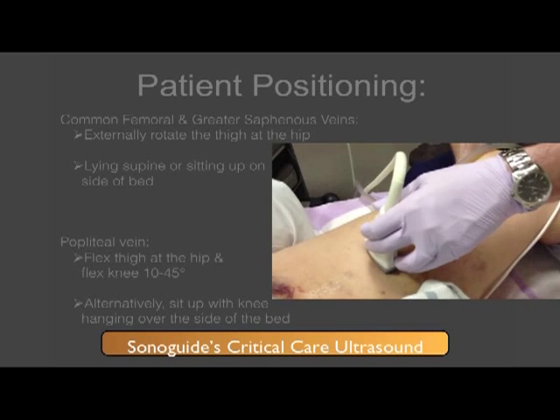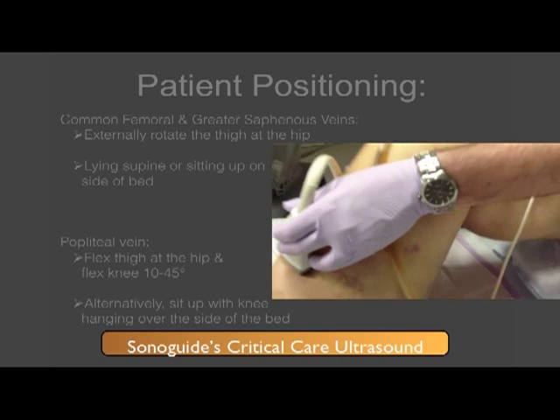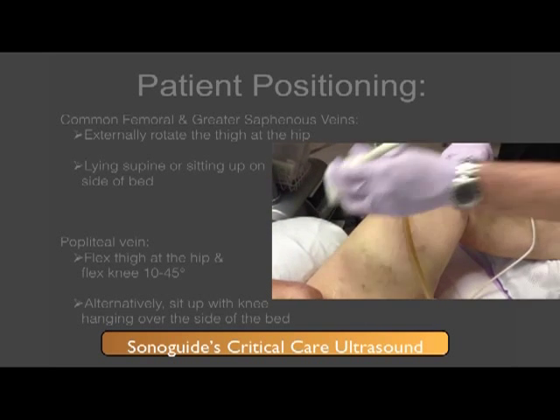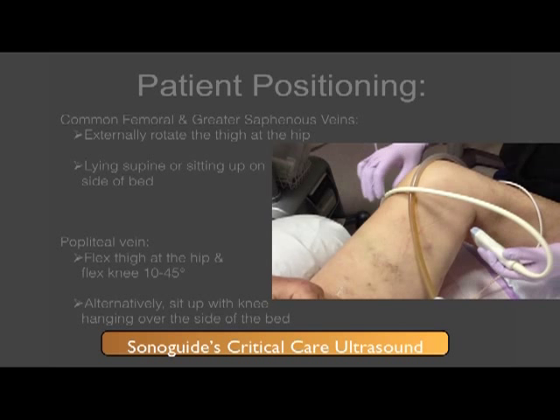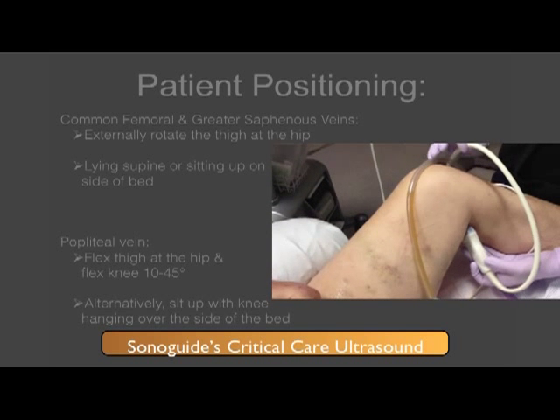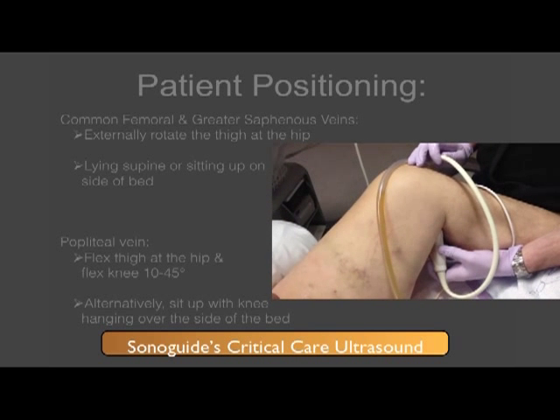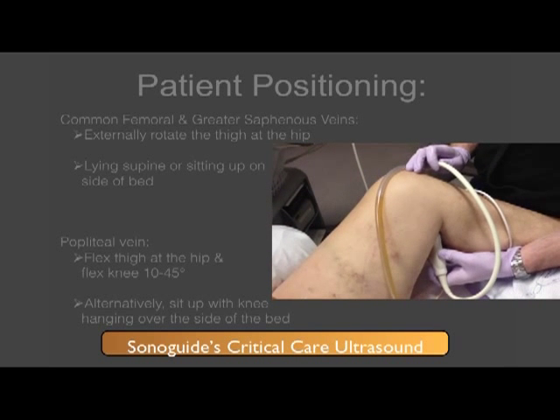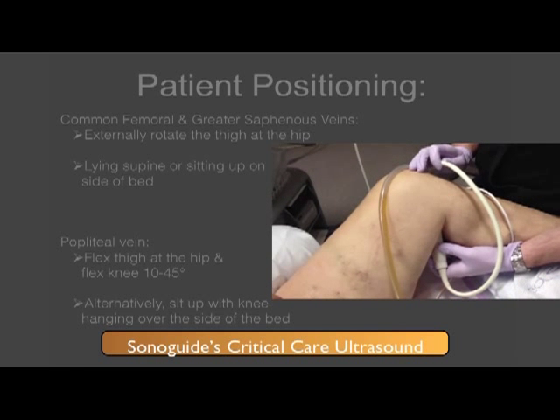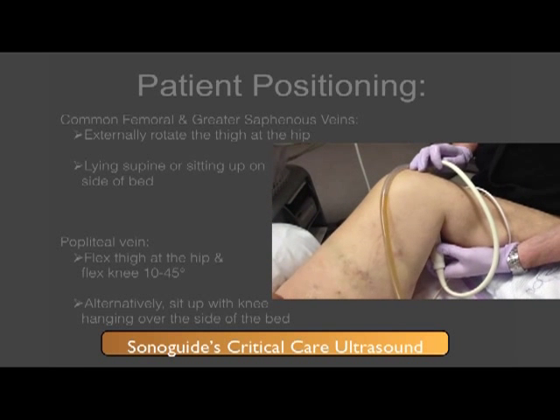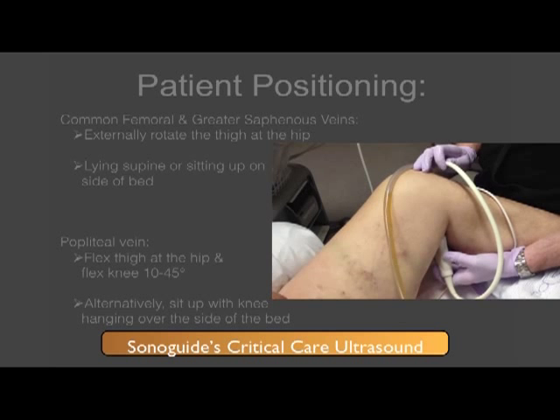Just like any other procedure or skill, it is important to properly position the patient. For the common femoral and greater saphenous veins, it is helpful to externally rotate the patient's thigh at the hip. This can be done with them lying supine or sitting up over the side of the bed.